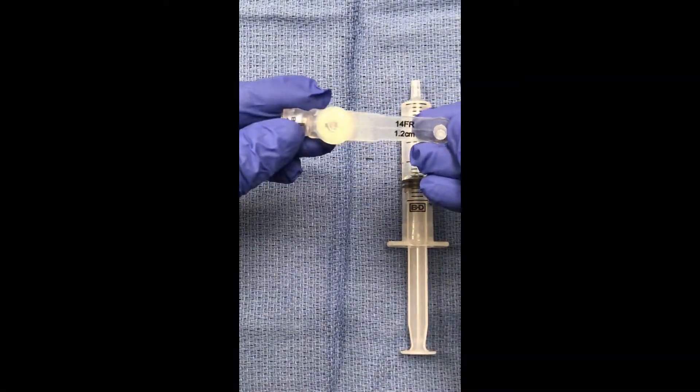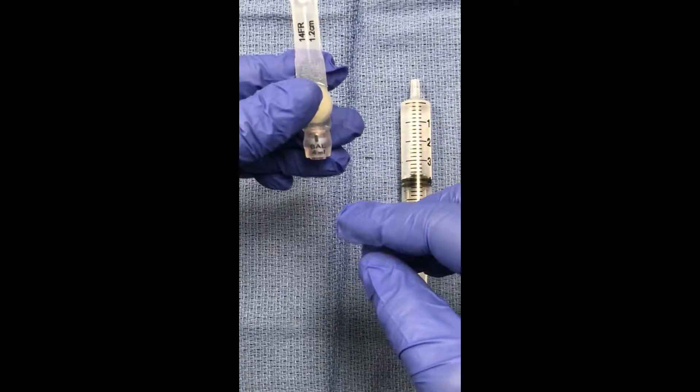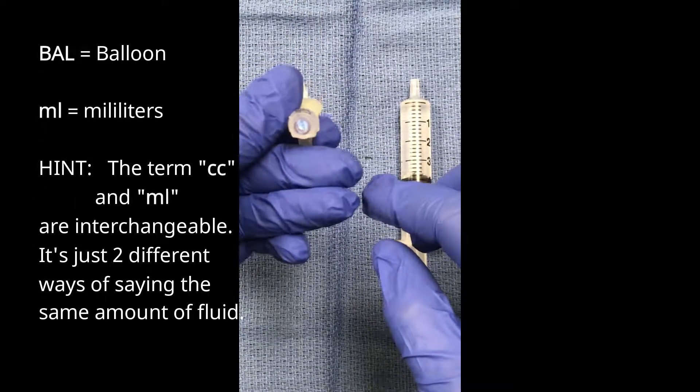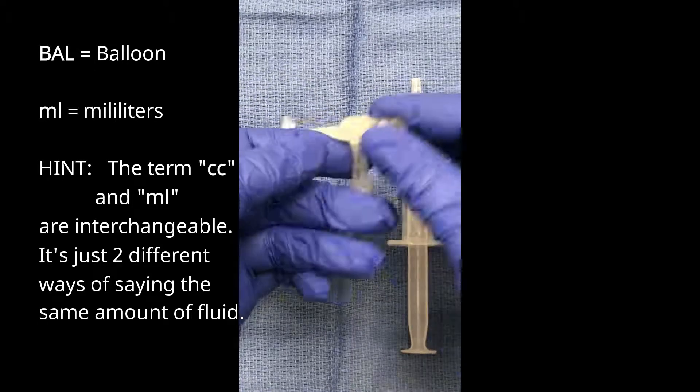If you also notice on the side, there's a blue port that's labeled. It's got a straight line, the letters BAL and 4ML. The 4ML relates to how much volume you need to inflate the balloon.